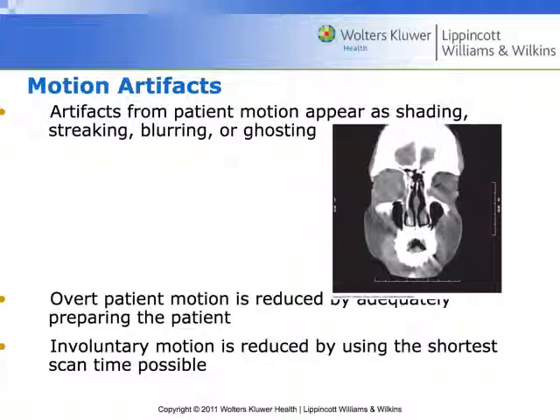There's a lot of internal farting that people do, and that can cause a lot of motion on the images, right? It's like the stuff has to fart from the small intestine to the large intestine, and you get motion there, and if you're trying to find their appendix, that internal fart can cause problems, right? We're going to call that involuntary motion, not internal farting, but the best way to reduce it is to reduce the scan time to something that's as short as possible, right?